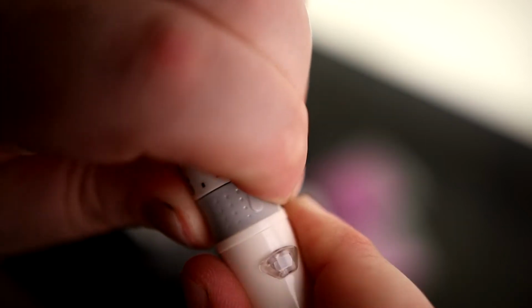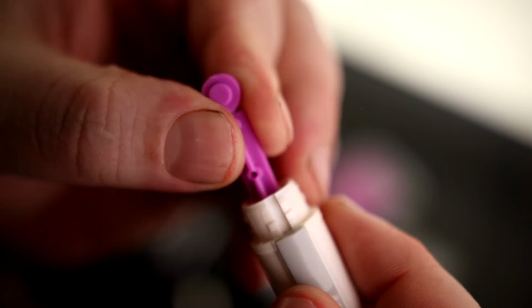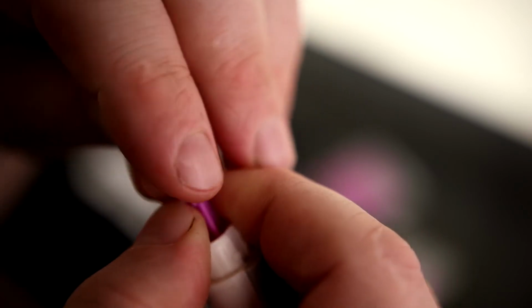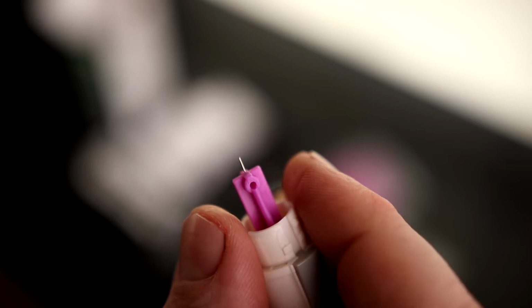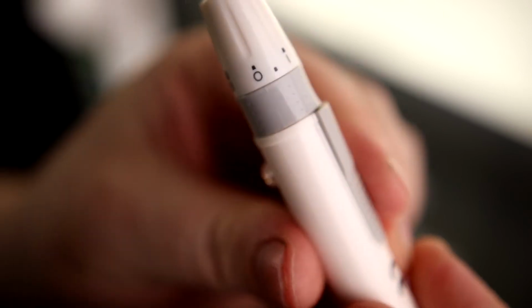And to put the lancet in, we're just going to twist the head off. And the lancet comes in a little package like that. We're just going to push that in here. And then twist the head off. And there is the needle. So carefully put the cap back on. Pull this back. So now this is ready.